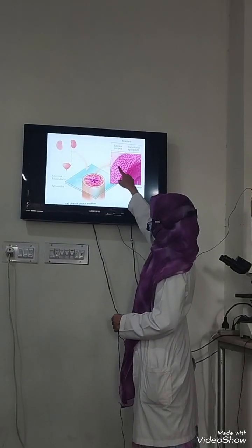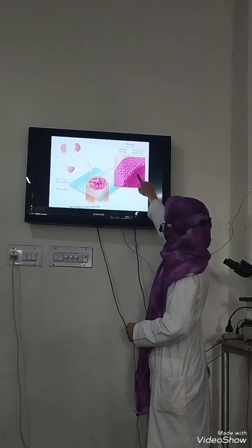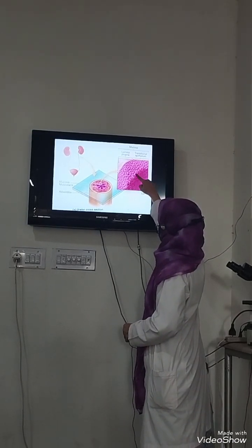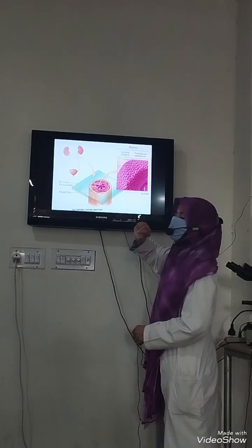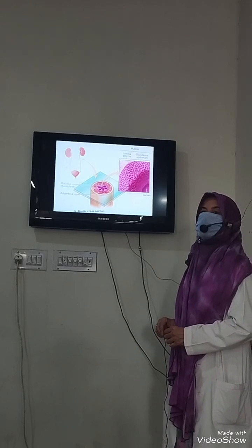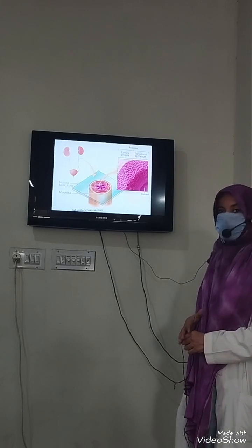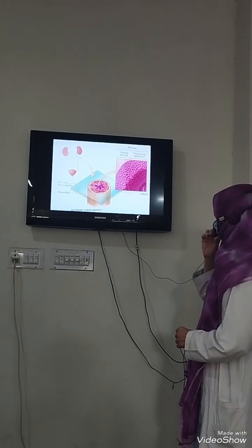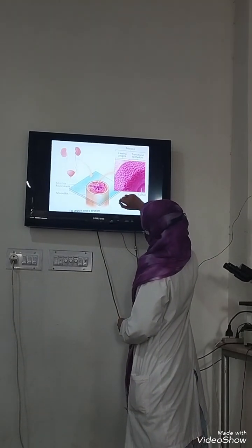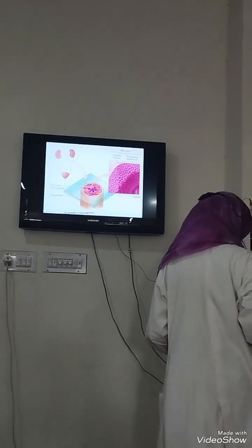Later on they are changing their shape and adapting different shapes like polygonal shapes. But when they reach the apical side, you see they look like a dome-shaped cell. So due to this feature, these cells are called umbrella cells. If somebody asks you where lie the umbrella cells, typically in the urinary bladder you should mention, right? So the transitional epithelium here is accordingly. And there is another thing we will see in the other picture, the apical plasma lemma. What is special about it? Let's see.